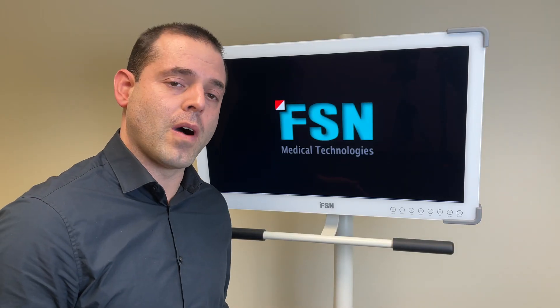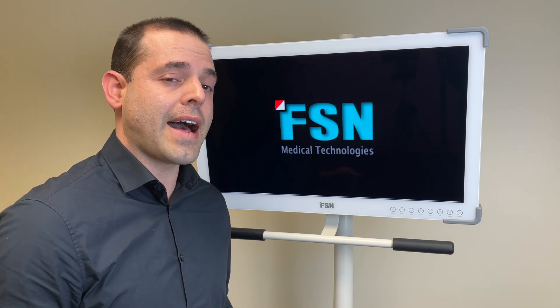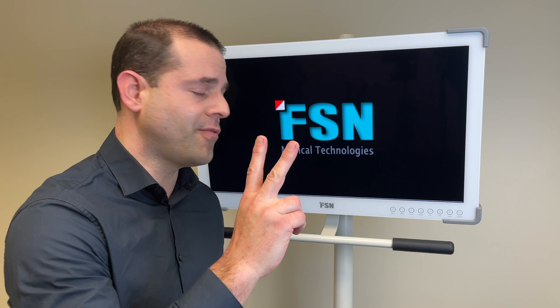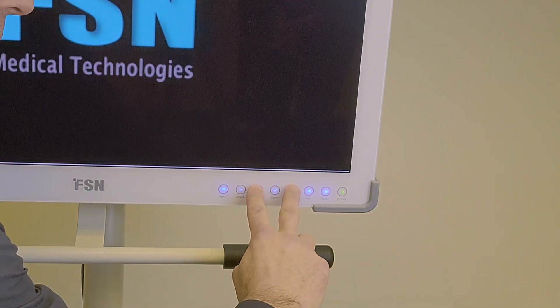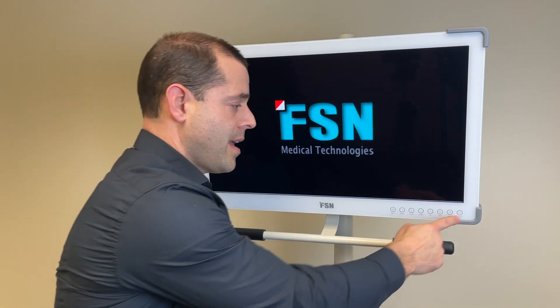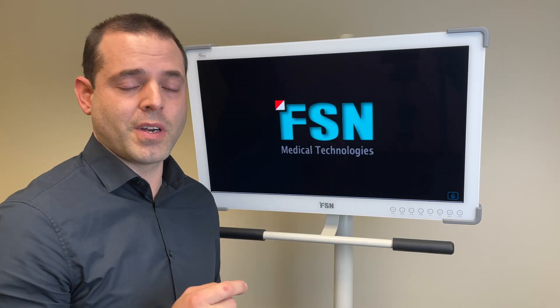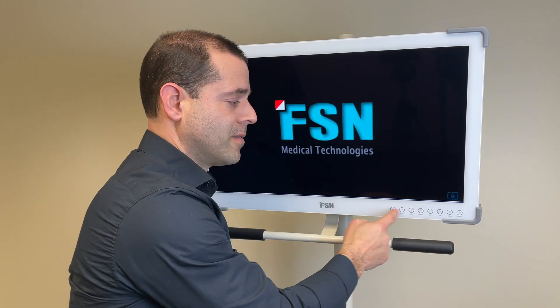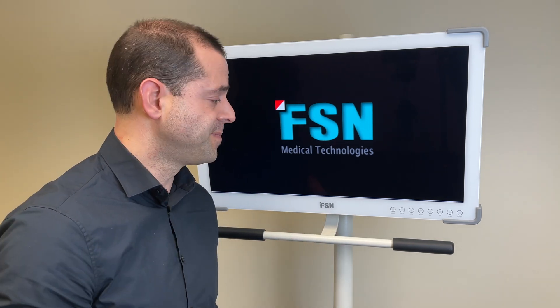We have this just the way we want it, so to keep it that way we're going to use the lock function. Take two fingers and press plus and up at the exact same time. It's now locked — there is no chance for inadvertent button pressing to change it or power it down, keeping your monitor perfectly safe just the way you want it.